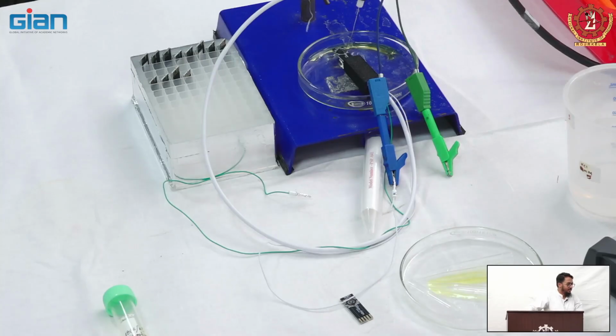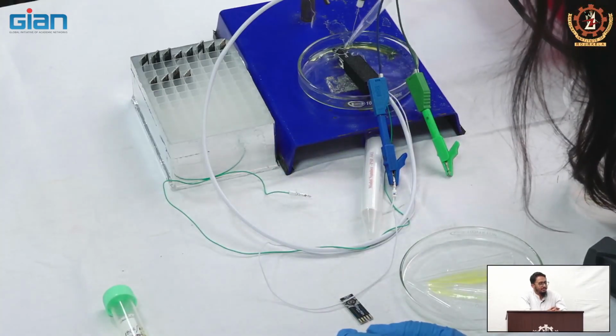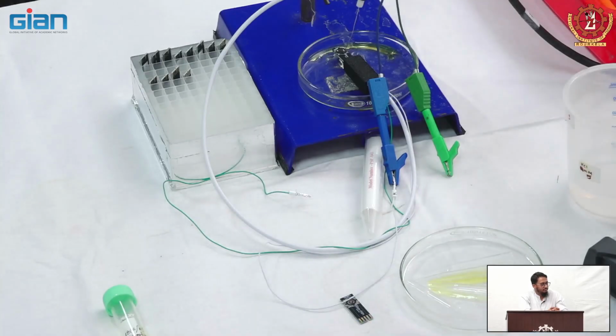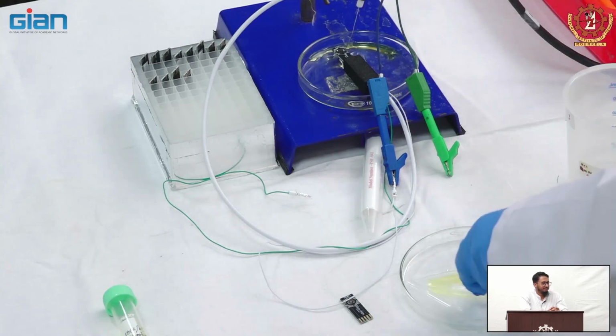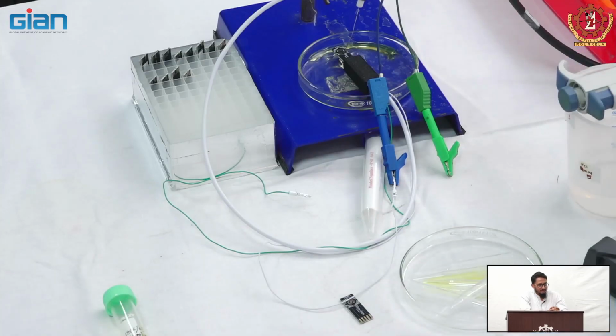This is PBS. Yeah. So, we are going to now put PBS on the electrode surface. Rishita is applying PBS on the electrode surface. One more very important thing to remember is when doing these lab experiments, please use the gloves, because if you touch the sensor surface with bare hands, it might spoil the sensor.